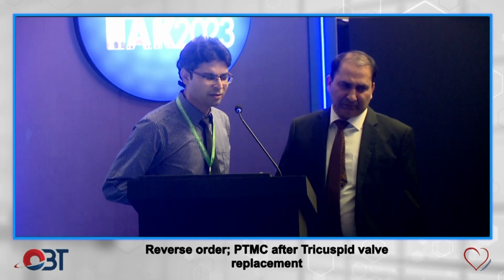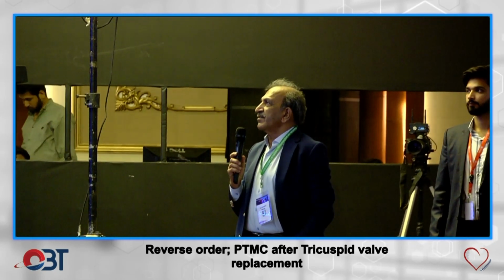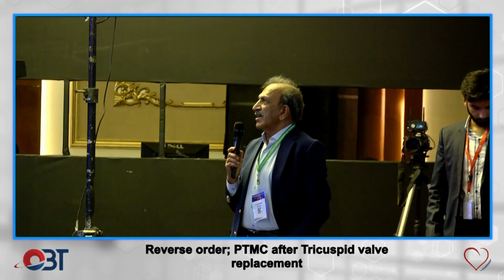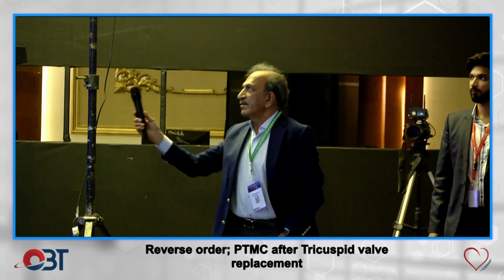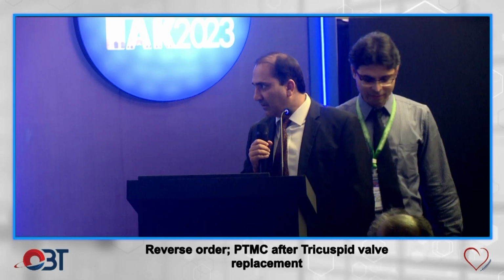Regarding this right ventricular pressure, if you have difficulty in doing that by Doppler, there are other ways to do that. You have to take the right ventricular outflow tract TVI, and then you can calculate mean pulmonary artery pressure from that. One can do that very routinely. थैंक यू वेरी मच, नाइस डिस्कशन. You can take these pressures from echo as well. Thank you, Dr. Farhan.